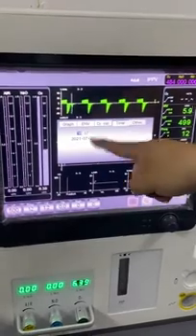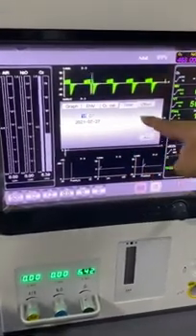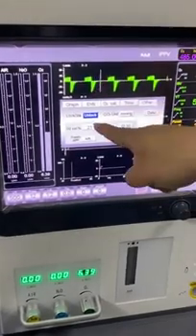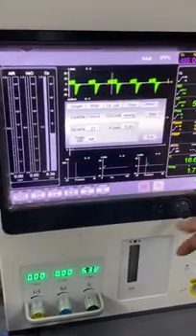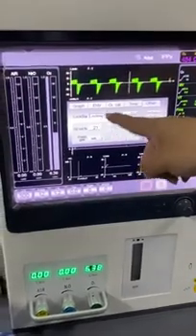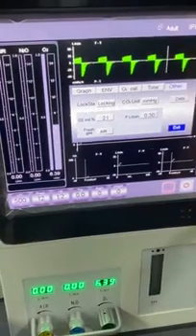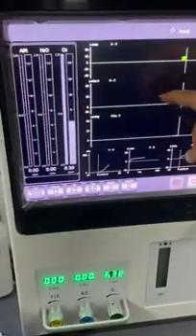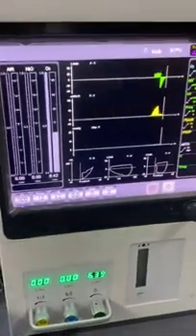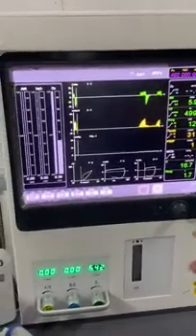And the fourth column is for the time setting, because we know the time difference, so just set your country's time. And the last one will be the data lock. And here we can lock the data. For example, once we show in the lock, it means we will see everything on the screen, and the doctors can take a screenshot for the immediate situation. And then later we can do some research to know what has happened to the patient.